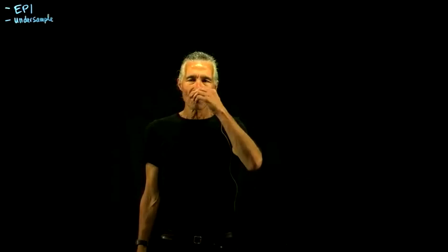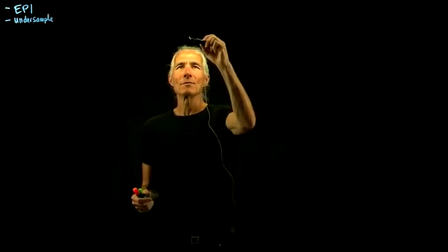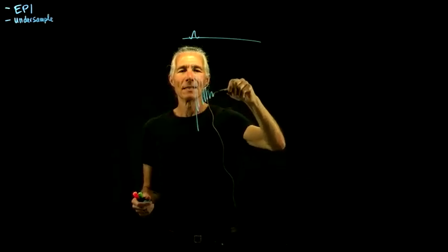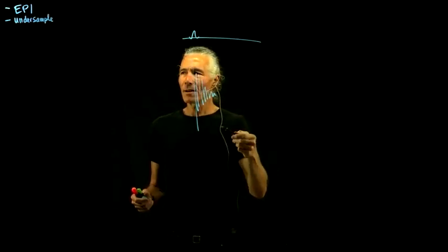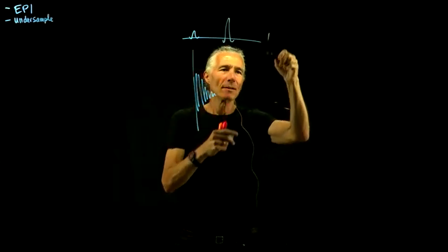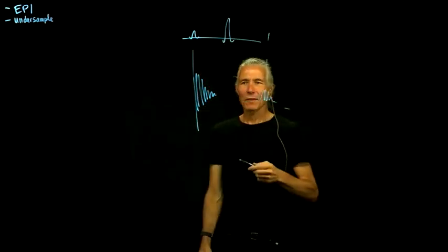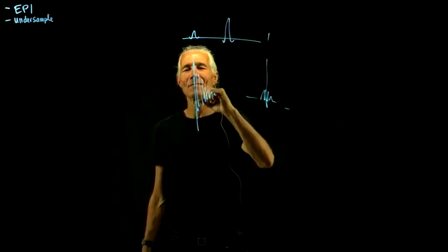When we normally think of the pulse sequences that we've shown, especially the slow versions, you do some pulse, and that causes an FID, and then maybe you turn some gradients on, or do another pulse and get an echo. If you're doing spin echo, you would do a 180, and that amount of time later you get an echo, and then you record that echo. But where is the biggest signal? It's right here, right at the very beginning. That's the biggest signal by far.